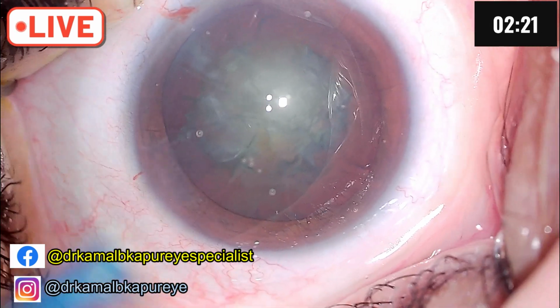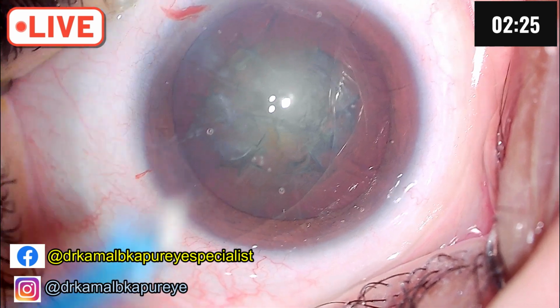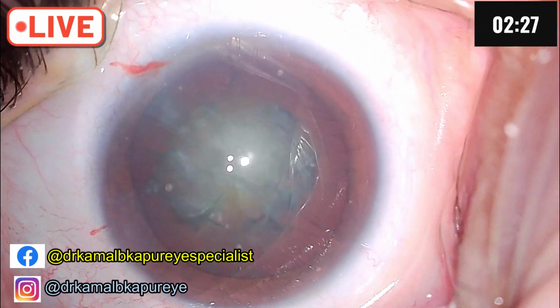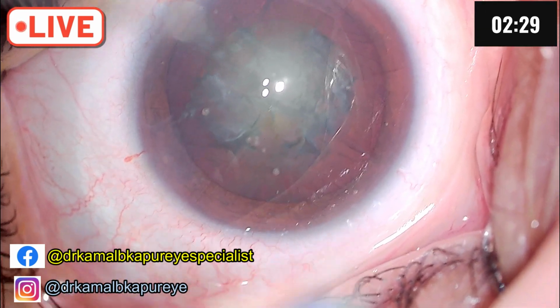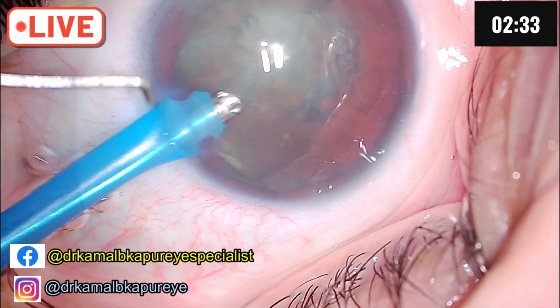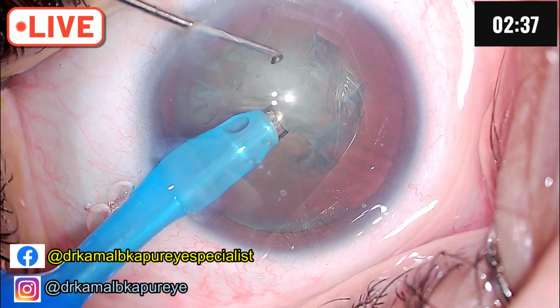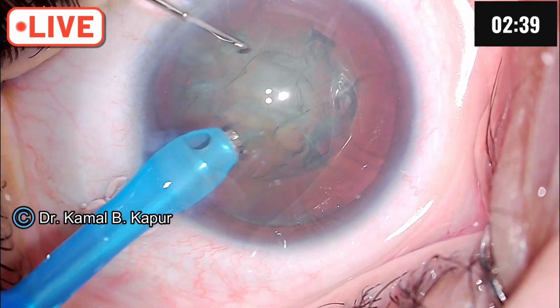Okay. Now, this surgery is under topical, but if there were 12 cuts or more, I would have usually gone in for the case under block and gone in for a scleral approach. My regular bottle height is 110, but here I will go for approximately 105 to 100 millimeter mercury.